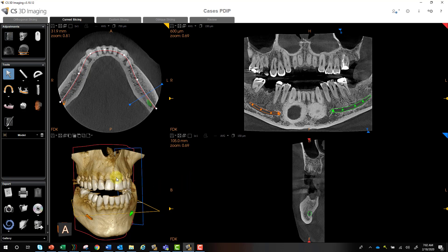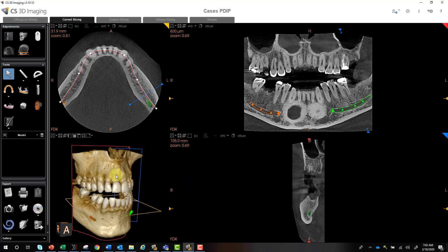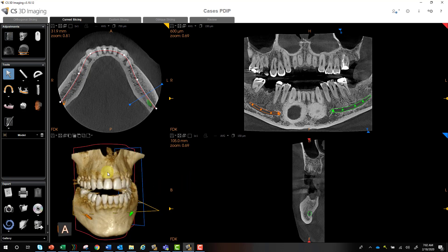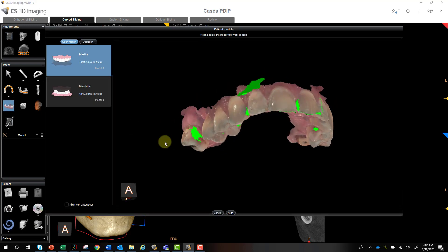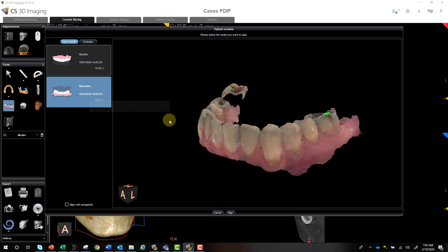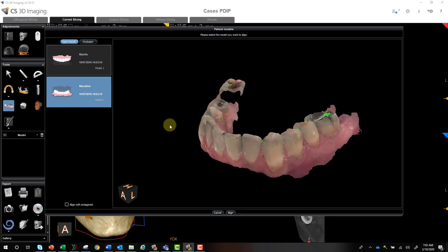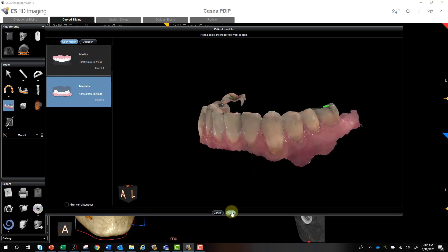So if we have a 3600 or 3700, or if we've object scanned an impression or model, and you have the PDIP module — Prosthetic Driven Implant Planning — those will then be available within our model icon over here. So we can select that, and you can see here is a 3600 scan, and we can go ahead and do an automatic alignment with the mandible.